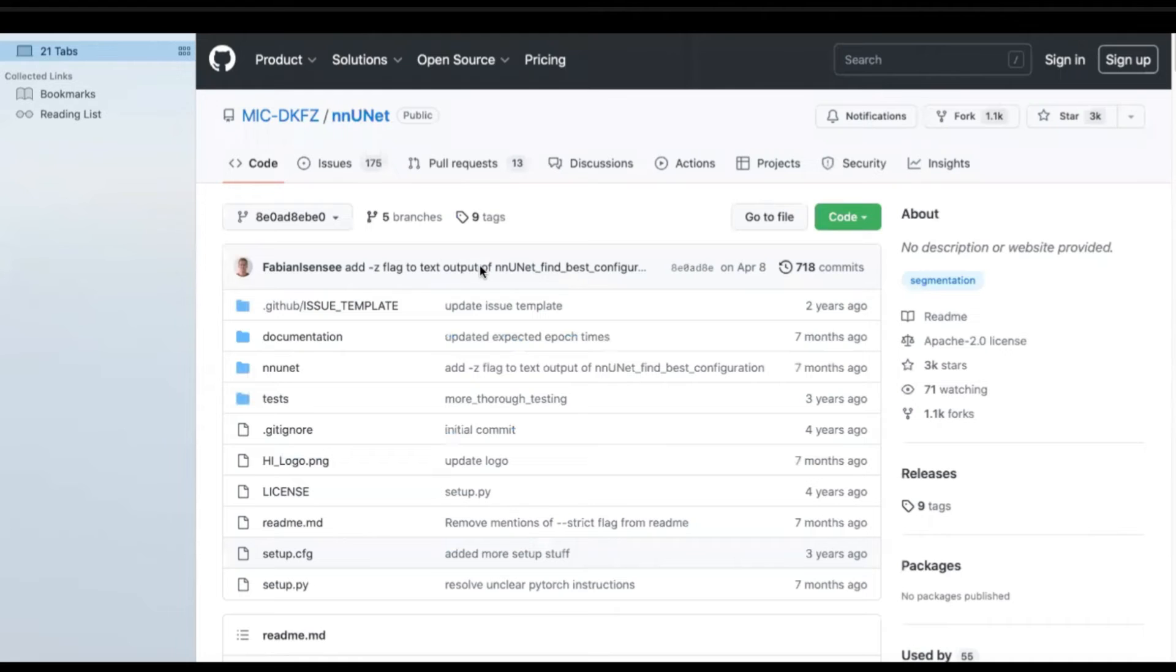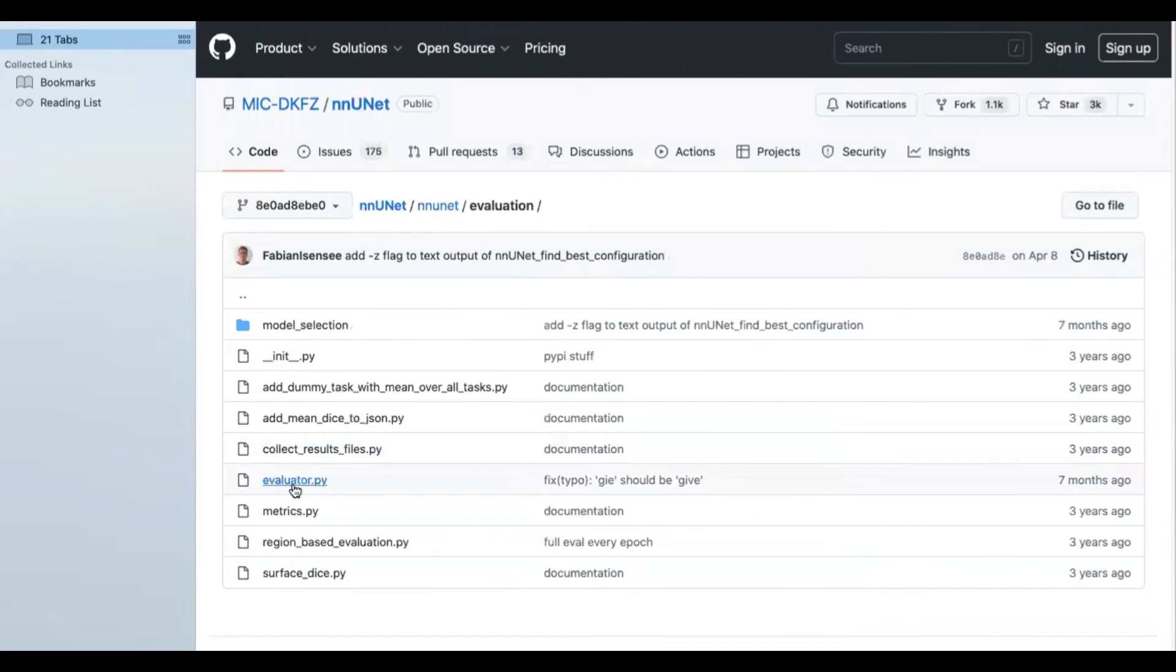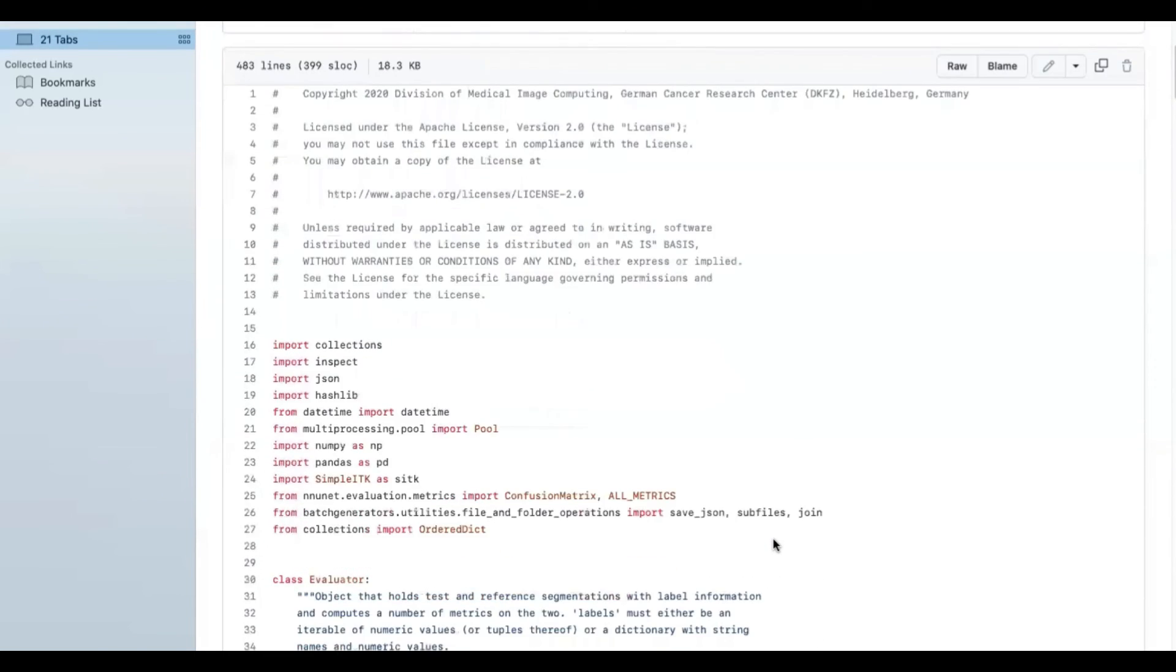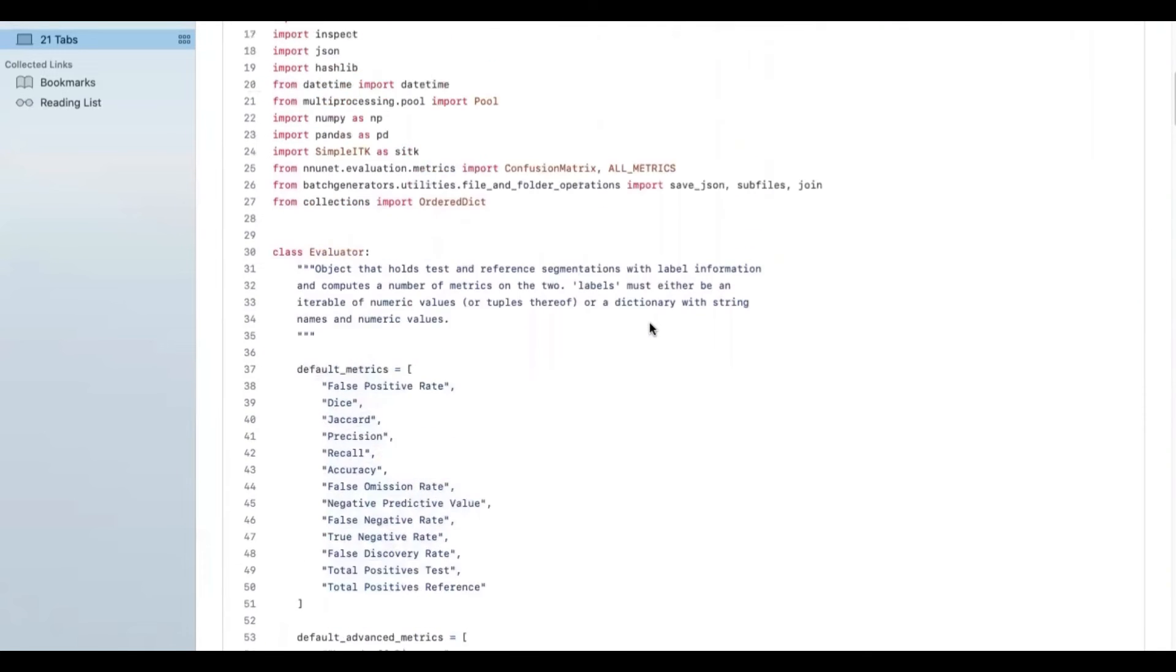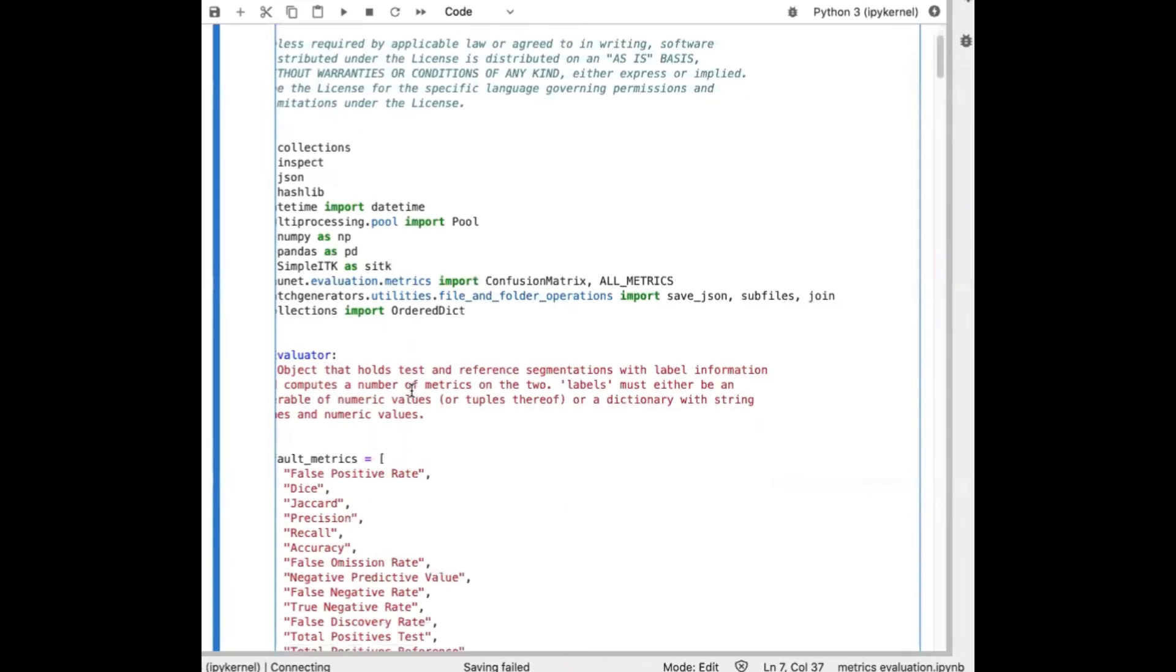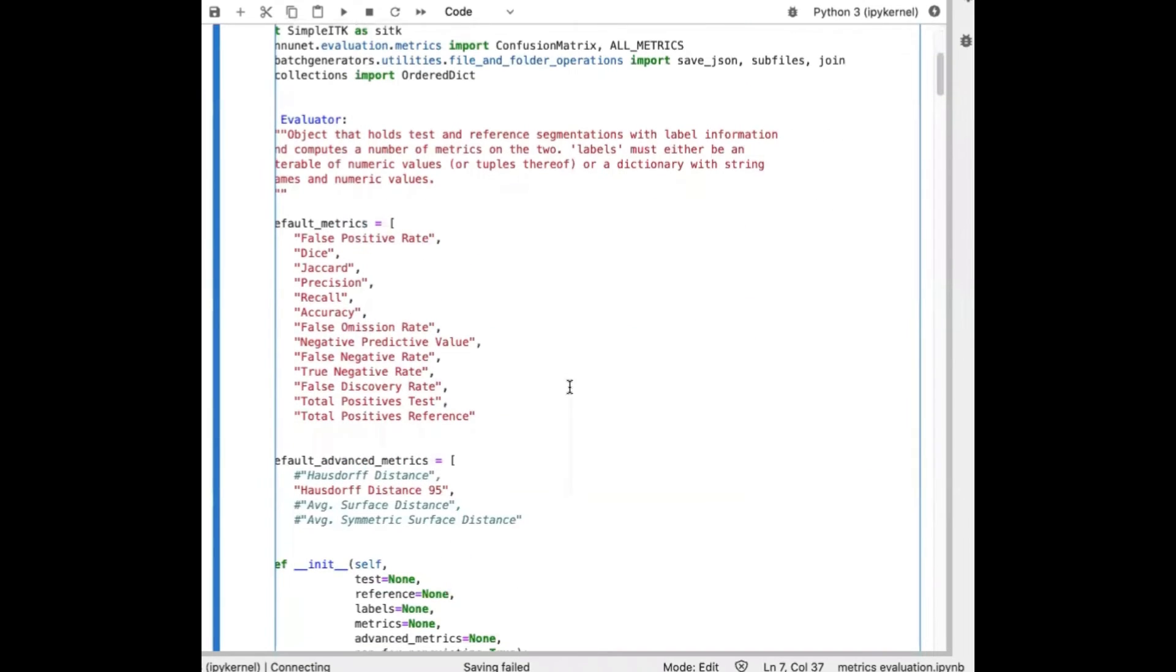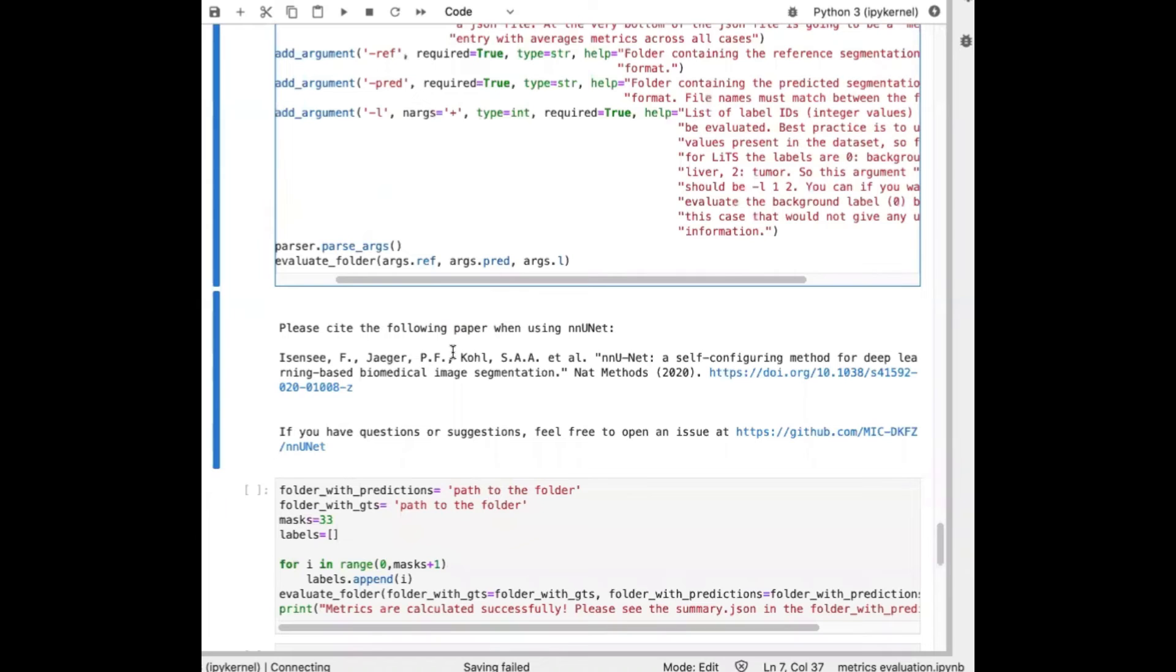The next step was computing the metrics. So again, going to nnU-Net page and then clicking on the evaluation and Evaluator.py, you'll see the metrics that are assigned as default metrics and advanced metrics. So I'll copy this command and I go to a JupyterLab notebook. I'll paste that there. And if you run this cell, you will see something like this.